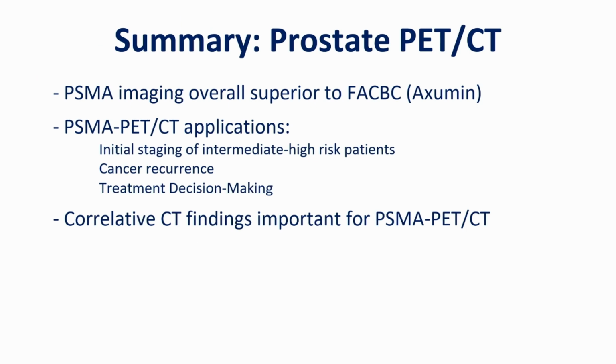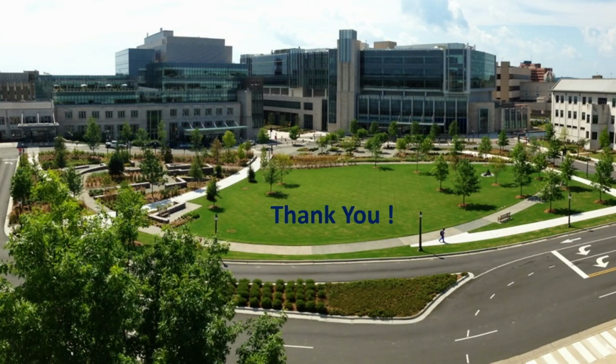So once again, in summary, PSMA imaging overall is superior to Axumin or conventional PET. PSMA PET CT has many applications in initial staging of intermediate and high-risk patients, cancer recurrence, as well as treatment decision-making. But it's really important that you have correlative CT or biopsy findings when you have a PSMA PET positive finding, especially if it's an unusual location. Thank you.